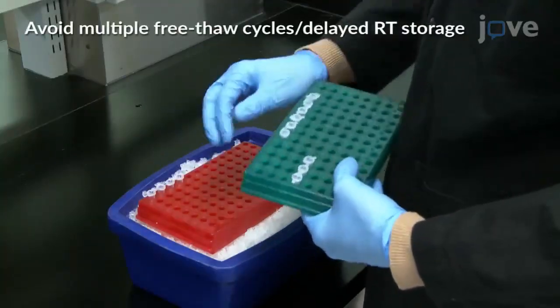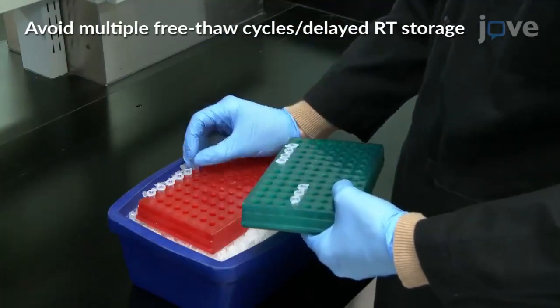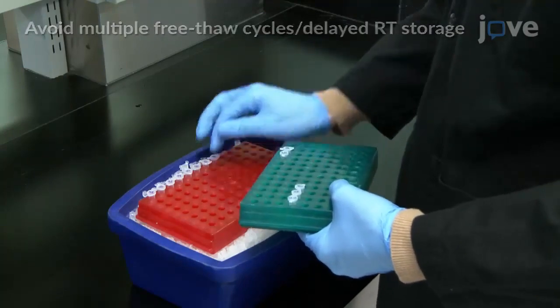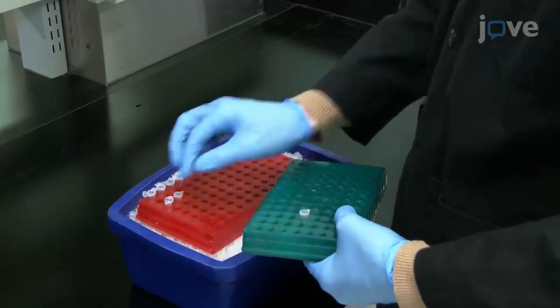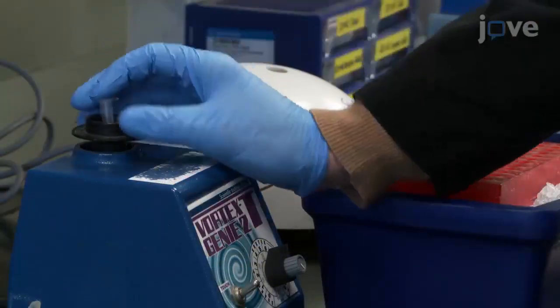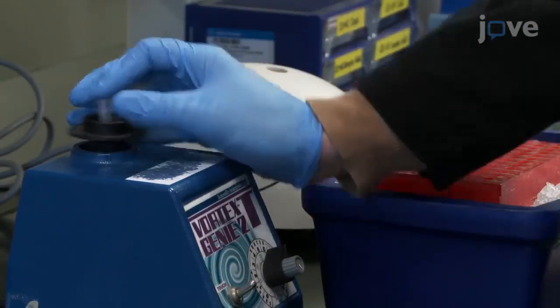Begin by thawing de-identified morning urine samples collected from patients with a known prescription drug history from -80 degrees Celsius storage on ice and vortexing the thawed samples for 30 seconds.